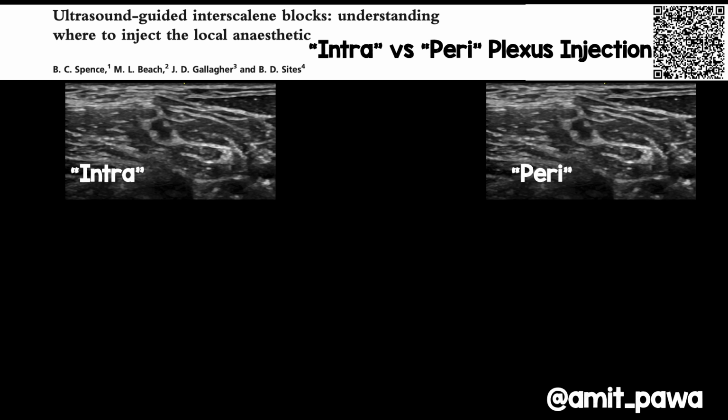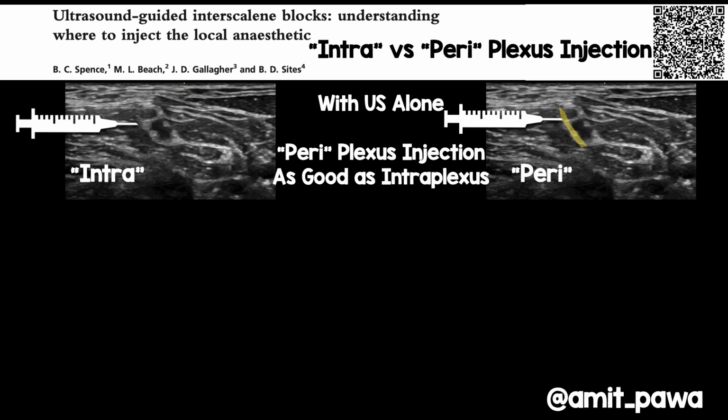Now, when I first started performing interscalene brachial plexus blocks under ultrasound, this is what I used to do. Go between C5 and C6, come above, go above C5, then go back again and inject between C5 and C6. It was very aggressive video gaming type of needling. But actually, all we need to do is to do a periplexus injection and inject local anaesthetic on one side. And when you do that with ultrasound alone, you will determine that periplexus injections are as good as intraplexus injections. So let's not be that aggressive.